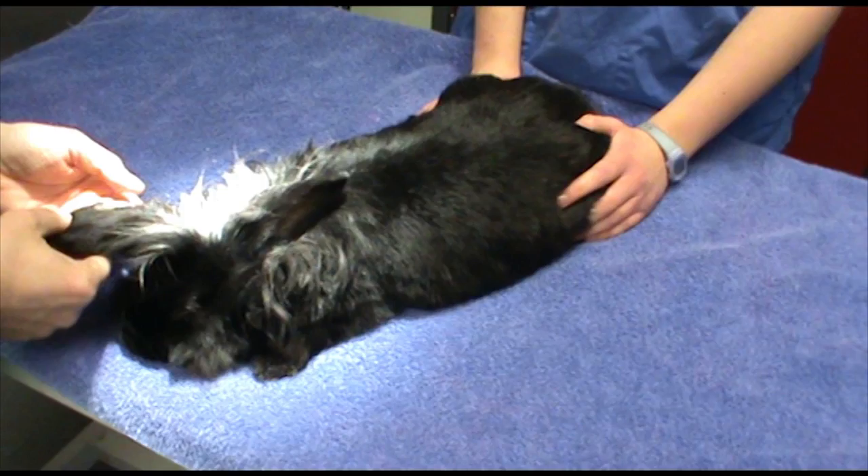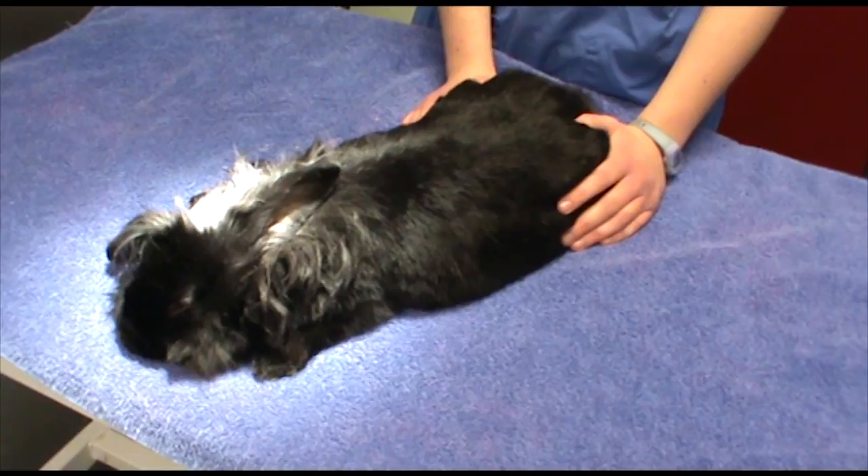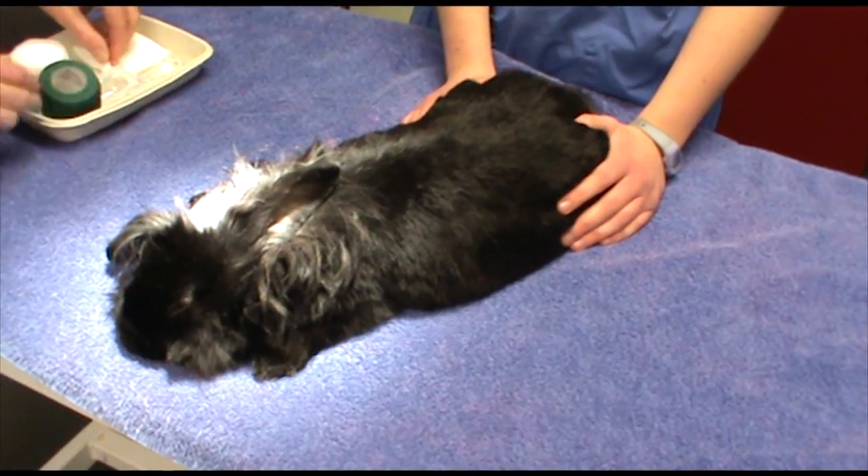This rabbit has been premedicated in preparation to be anaesthetised for routine neutering or spaying. We've clipped prior to applying the premed and applied local anaesthetic, so we're ready to go.